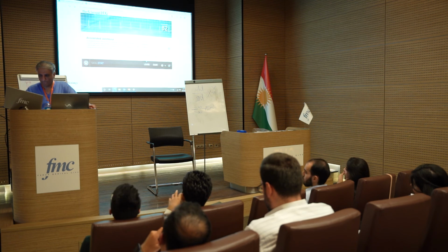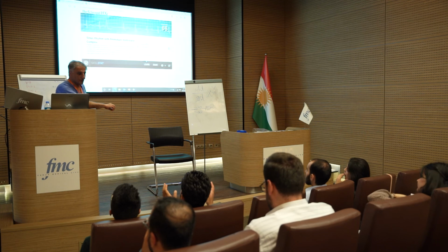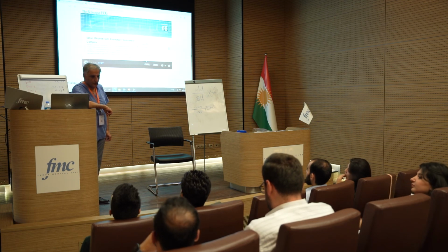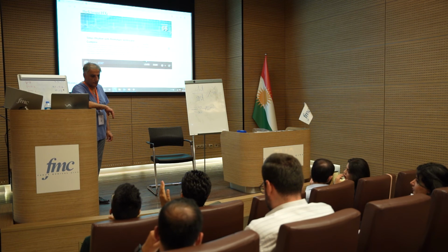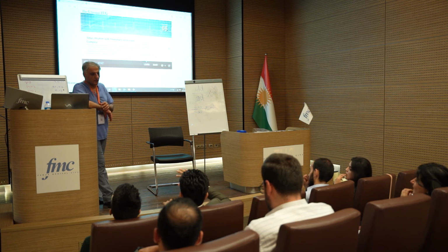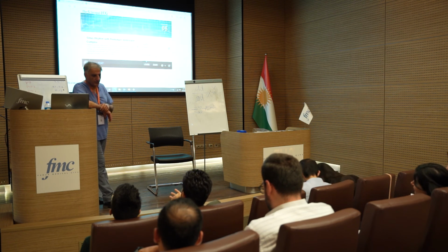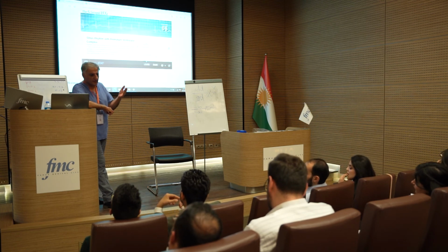But if it's junctional rhythm, then I think the space between the R waves should be broader, right? Slower, somewhat bradycardic, if the rate is from the AV node. Not necessarily. That's the fastest pacemaker taking over from the SA node.